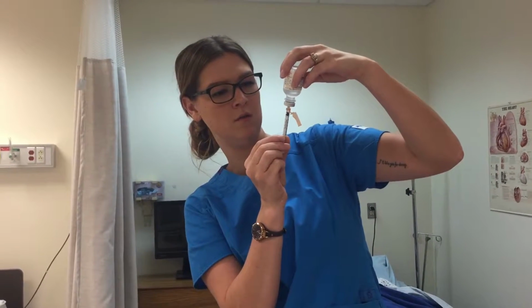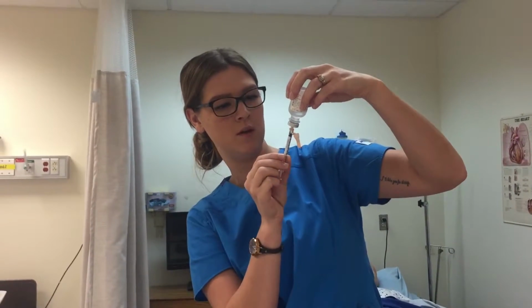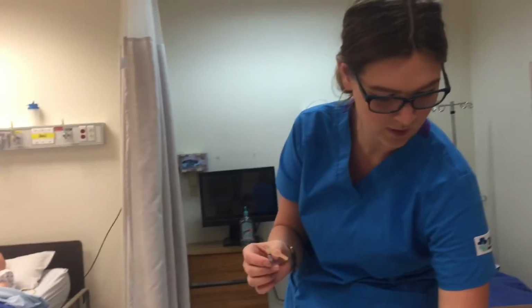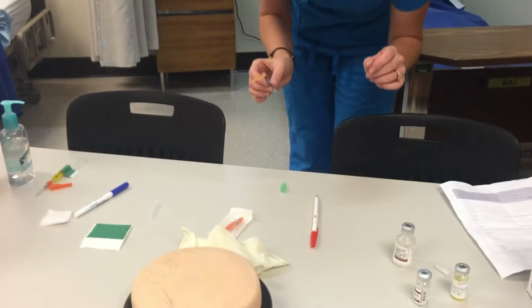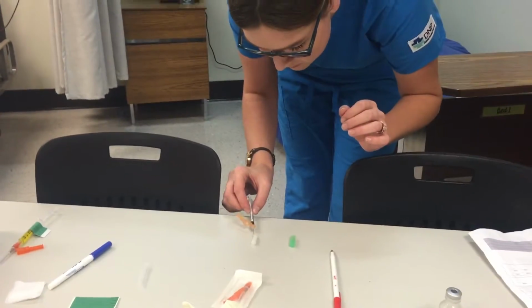It didn't work very well, so I have to pull the syringe. Okay, so I have 0.1 milliliters of fluid. And I checked this with my MAR. It is the correct dose. It is the correct medication. Here it is.